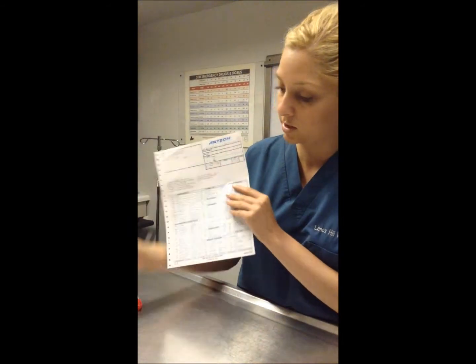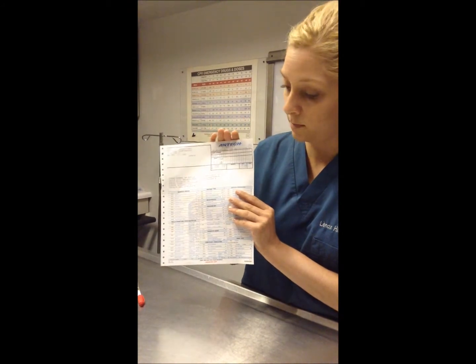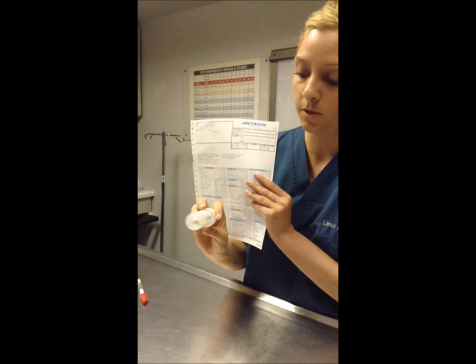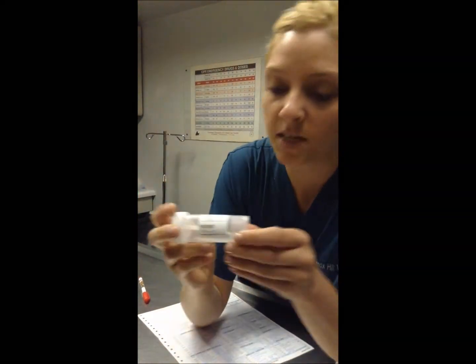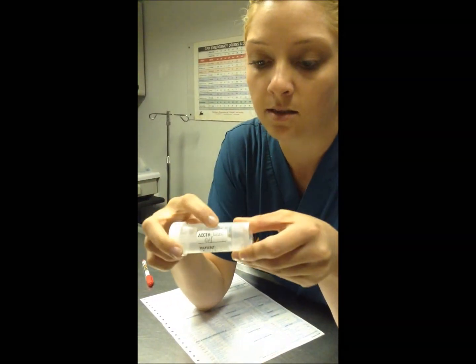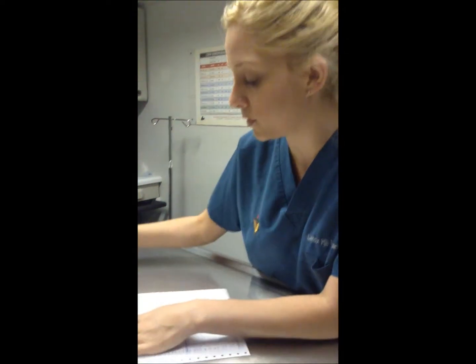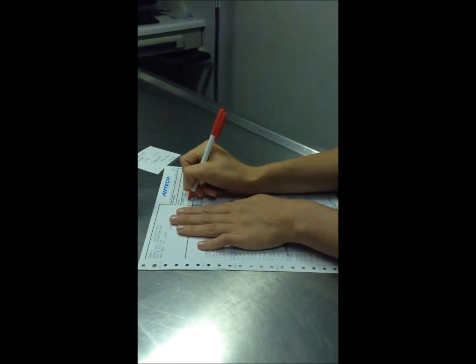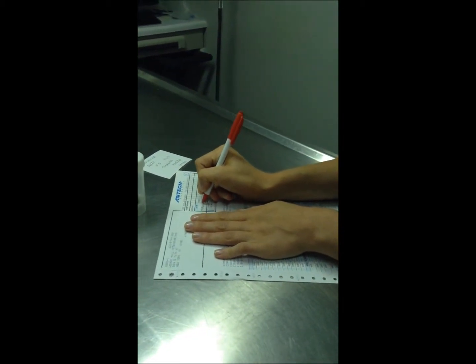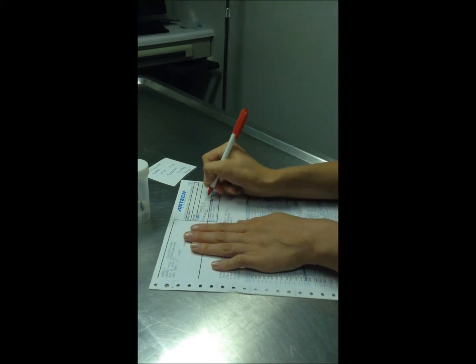So always wanna make sure that the patient's name is legibly written on the paper and is always written on the sample as well. So we're sending out a stool sample for an ovum parasite. So the patient's name is on there, and the account number and the test that we're going to be running. And then we're going to fill out this form to match what we're going to be sending out. So you put the date and clearly write in the patient's name.